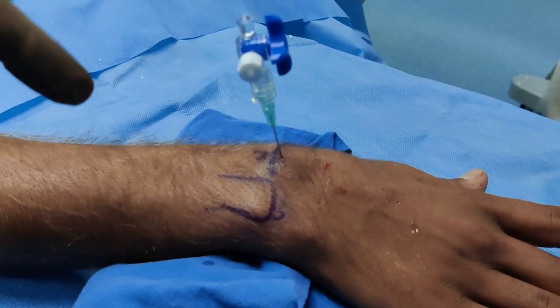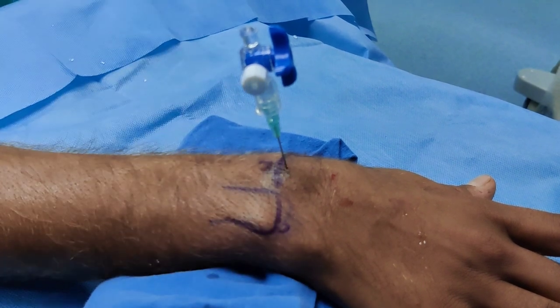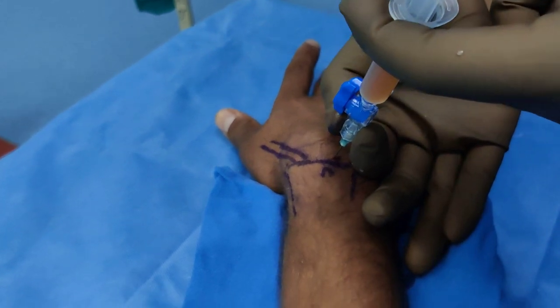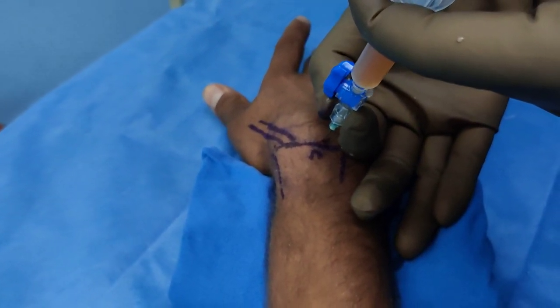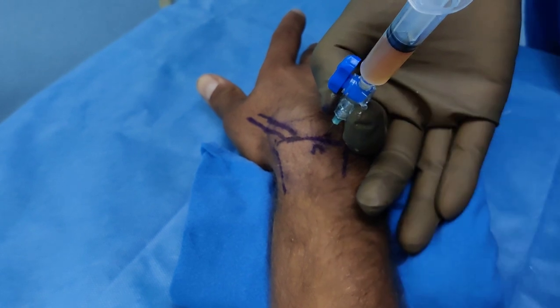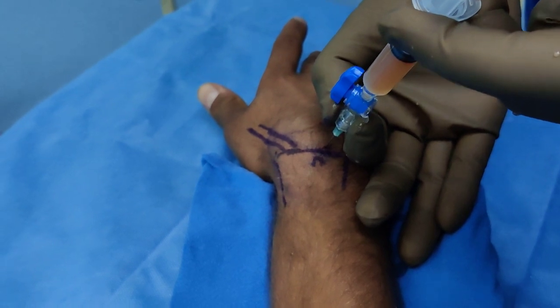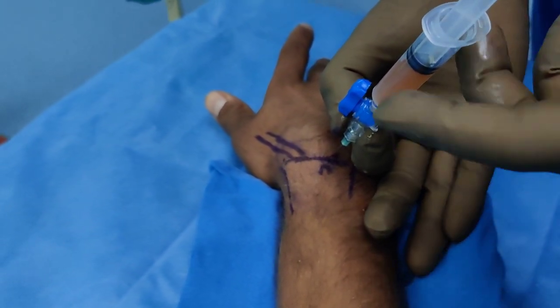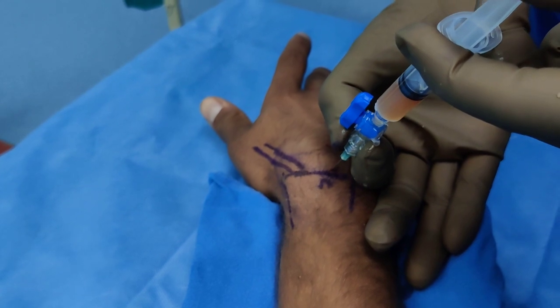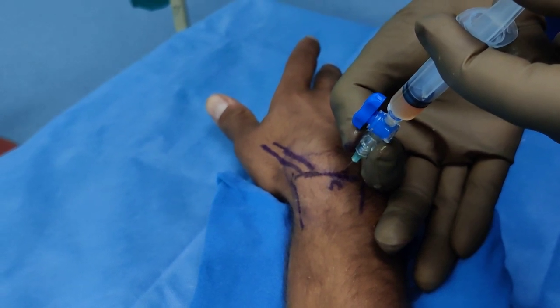The needle doesn't go in perpendicularly because the joint is at an angle, so going in at this direction makes it easier to enter the wrist joint. Gently inject the PRP into the joint. You can see back pressure — if you let go, the plunger comes back, which confirms we are in a closed space and in the right position. Just be gentle and go in slowly; it won't take more than three to four mils. I managed to inject three to four mils.